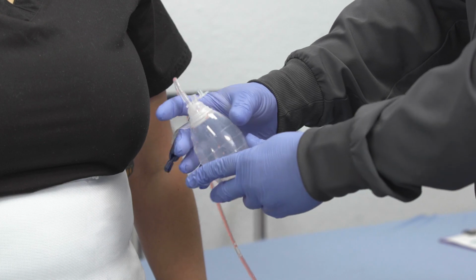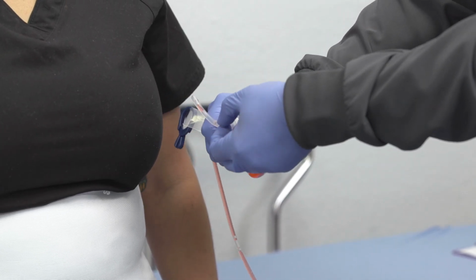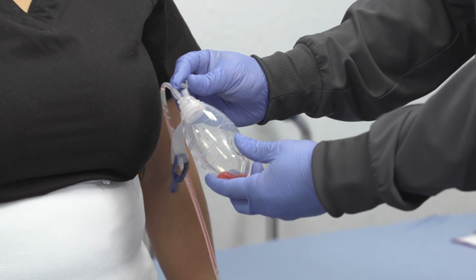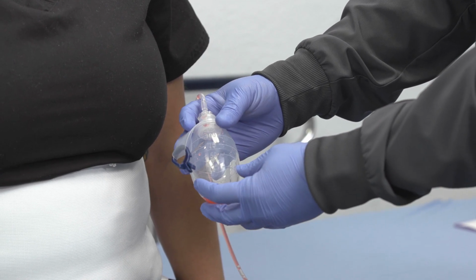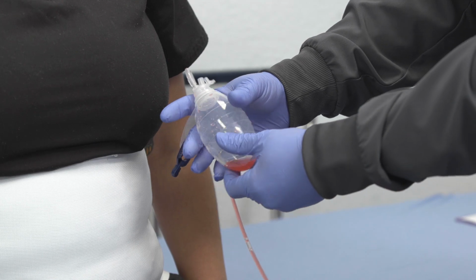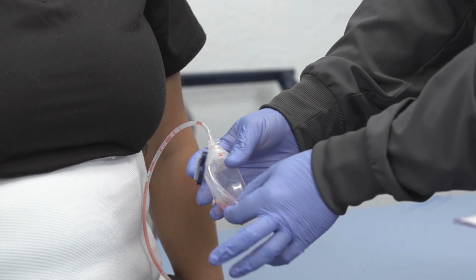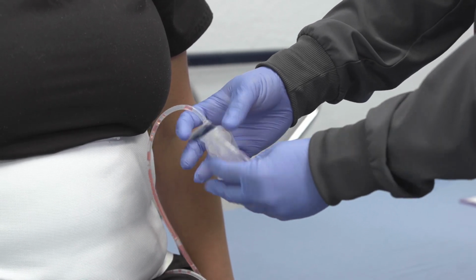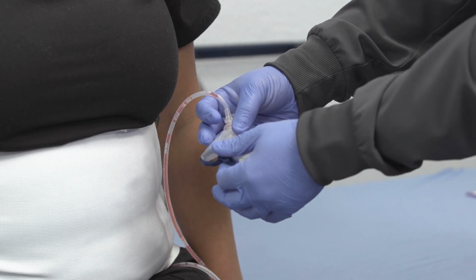Now with that, you're just gonna wanna check it again. Compress it, put the lid back in, and let go. If it decompresses again, just simply put the lid back on, give our office or our urgent hotline a call, let them know what is going on so they can let one of the surgeons know and the issue can be addressed appropriately. However, if you do check it again, you put the lid back on and it stays compressed, then it could have just been a simple issue of the lid maybe not sealing appropriately. But these are the 2 biggest issues you want to make sure you keep an eye out for when maintaining these drains.